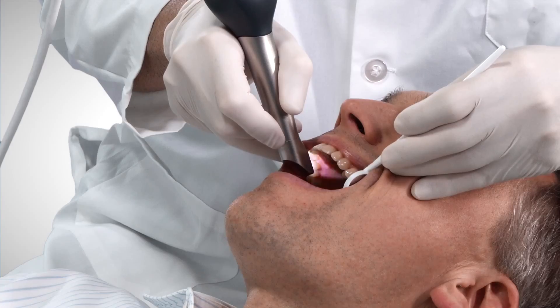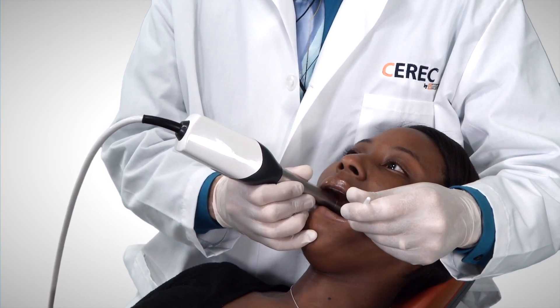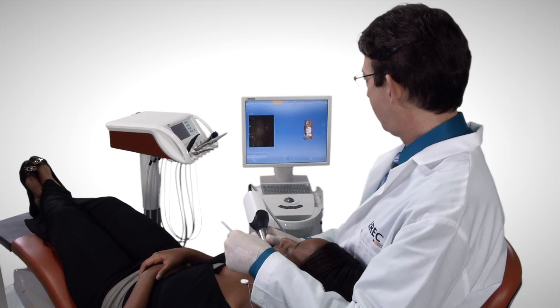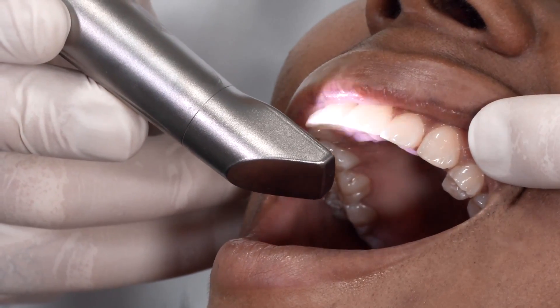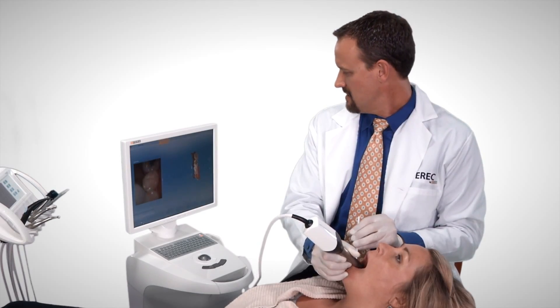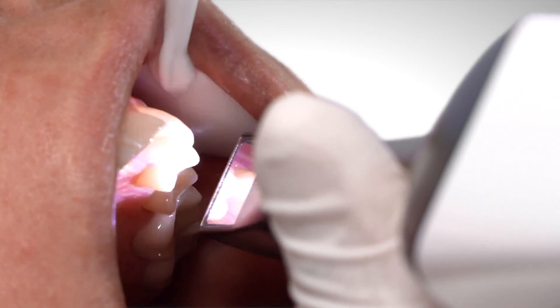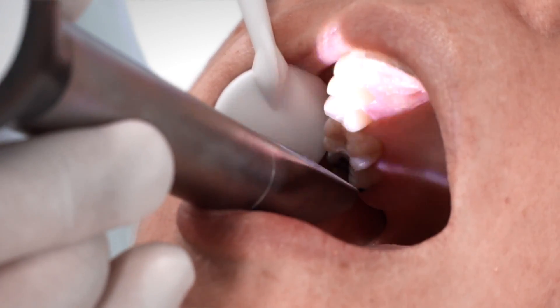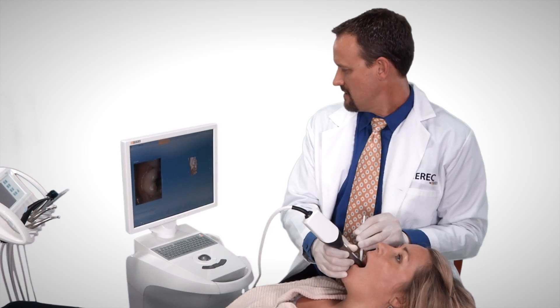Well, with the Omnicam, now that I've been testing for a while, I'm absolutely excited. This camera will scan soft tissues and hard tissues with the color reality that we see in the mouth. Patients like it. I have found that the clarity of the margins and the way to use it is very simplified. As we take this camera and use it for diagnosis and treatment planning, the patient can now see the different colors of their restoration, fracture lines, maybe even decay, root surface lesions, all of those things, including even gingivitis, right there on the screen and in three dimensions.